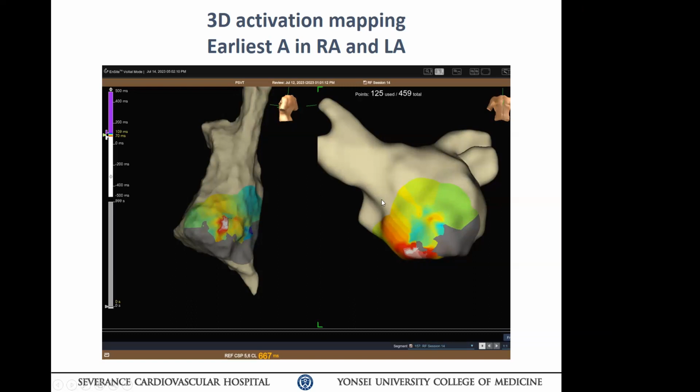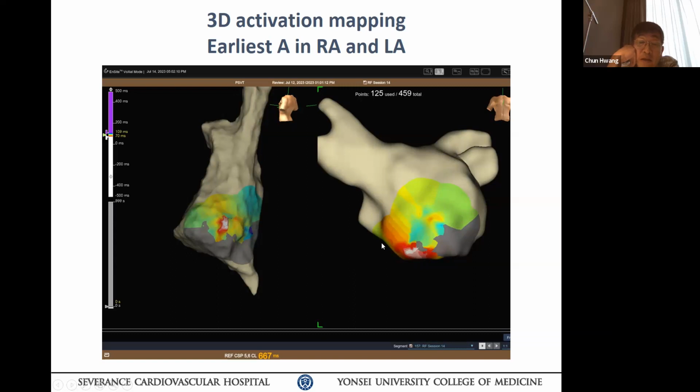그러니까 이거를 좀 더 트레이싱해서 매핑을 했어야 된다는 말씀을. 그렇지. 왜냐면 오리엔테이션이 생기는 게 두 문제가 있어. 하나는 이게 distal portion이 insertion 된 건지, 아니면 epicardial pathway가 sometimes they insert higher than annulus, away from the annulus. 무슨 말인지 알아요?